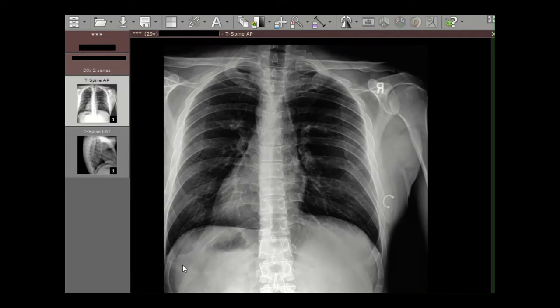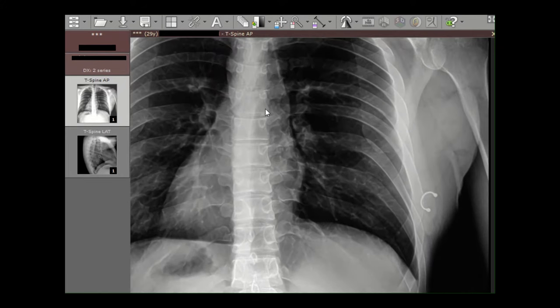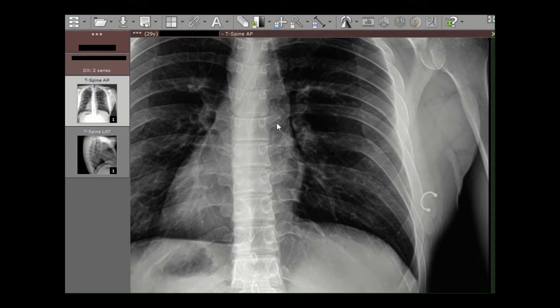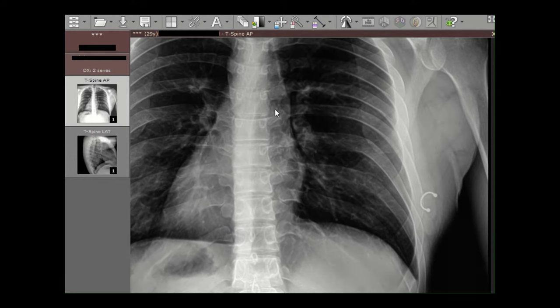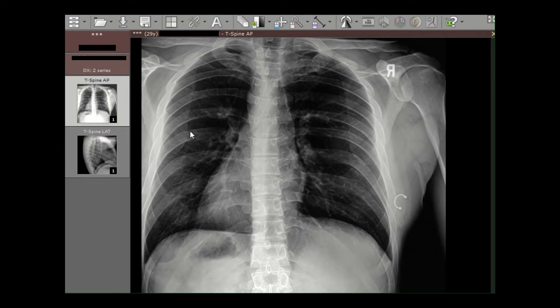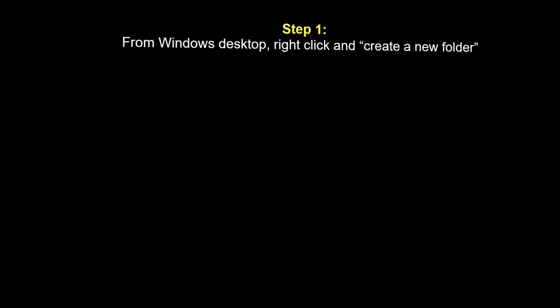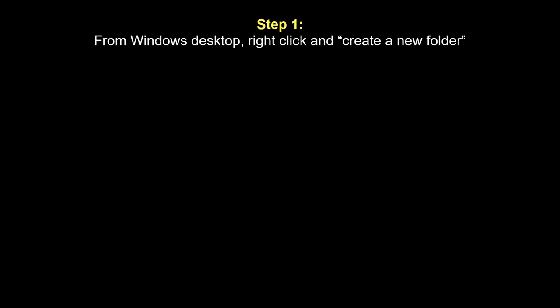You can adjust the image in order to best visualize what you're trying to see, and this cannot be performed with a JPEG. And again, that's why images need to be saved in this DICOM format.